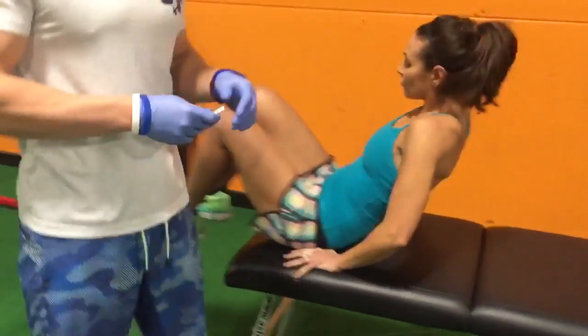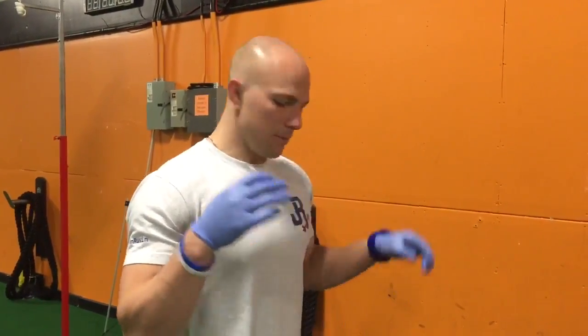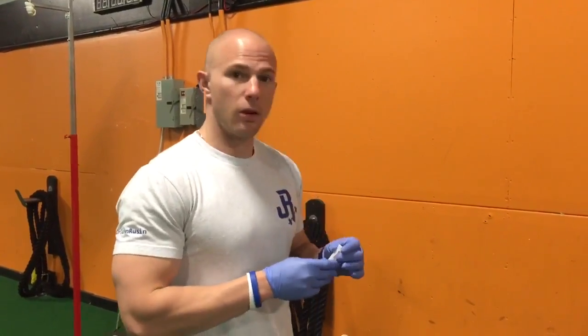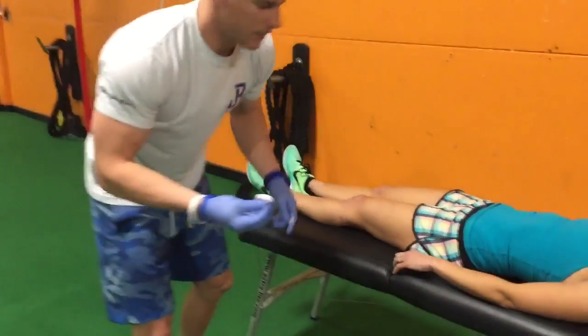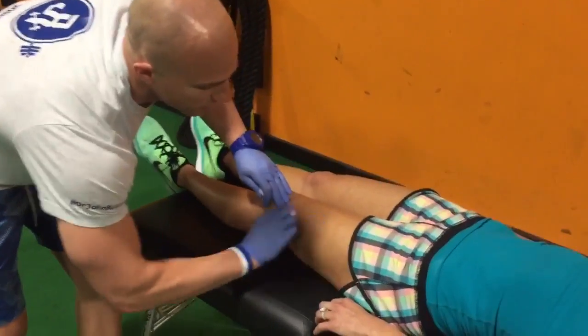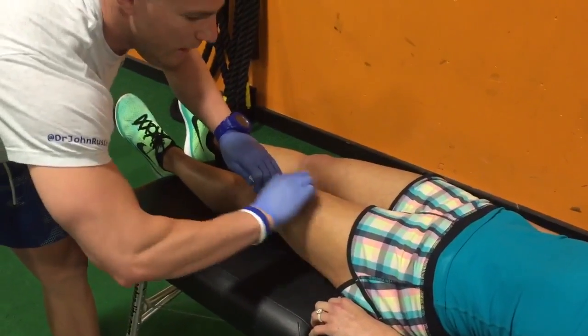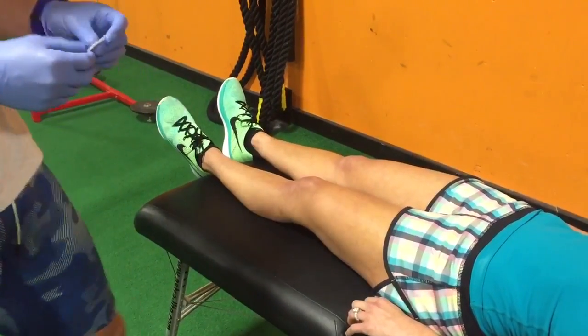Lay down on your back on the table. What we're going to do is palpate functional trigger points, insert the needles, use an e-stim unit on it, and then retest. Since dry needling is invasive, we are going to be using a clean technique — making sure I have gloves on, alcohol swabbing the area we're going to be treating, making sure that everything is super sterile.